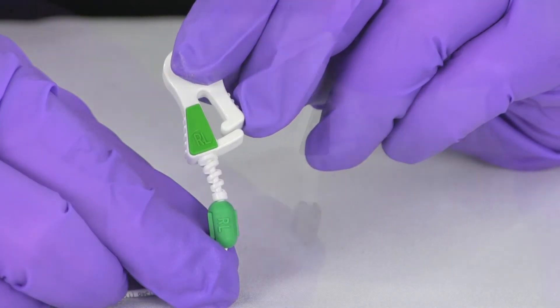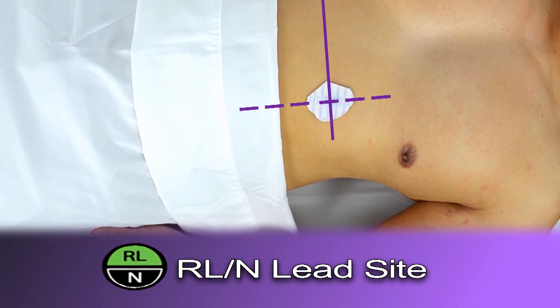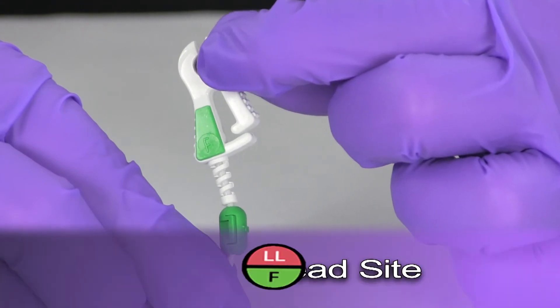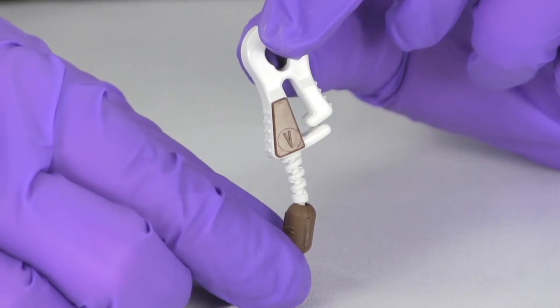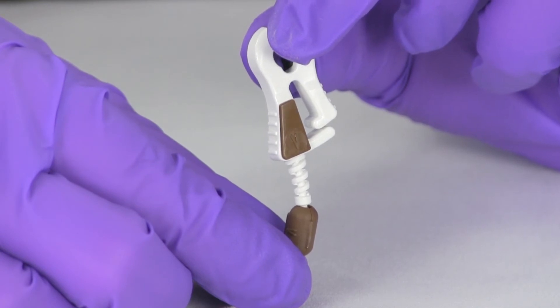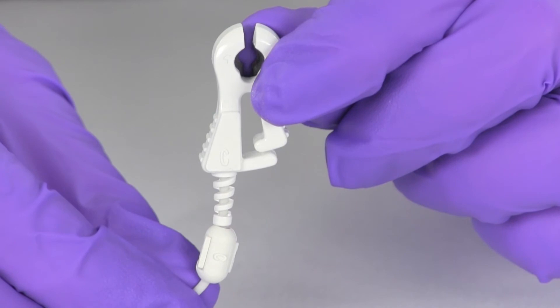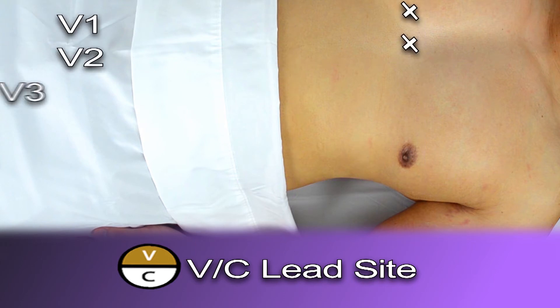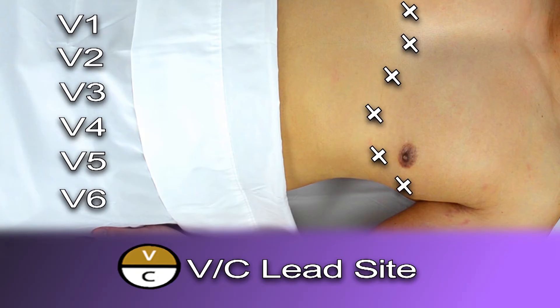The RL or N electrode site targets the intersection of the anterior median line and the patient's bottom rib. The LL or F electrode site targets the intersection of the anterior axillary line and the patient's bottom rib. The V or C electrode site's recommended placement is as close to the center of the application window as possible in MRI applications. The V or C lead can alternatively be placed in a traditional V1, V2, V3, V4, V5, or V6 location with certain patients.